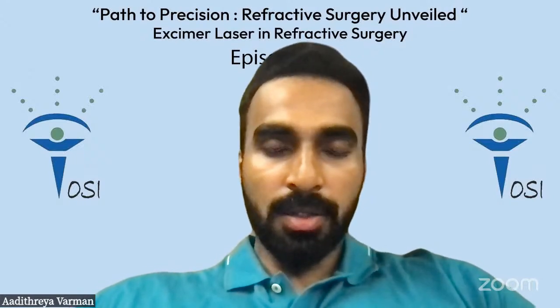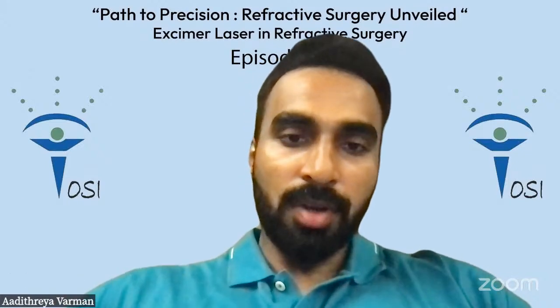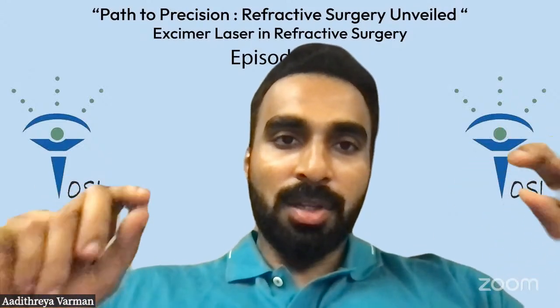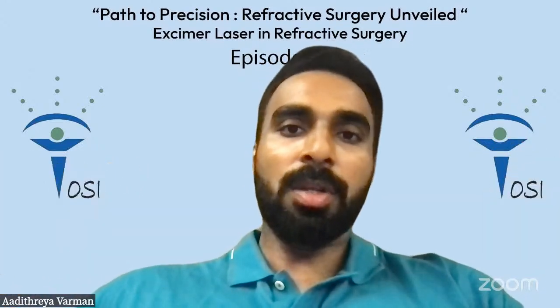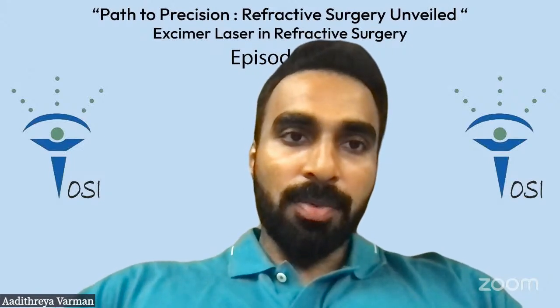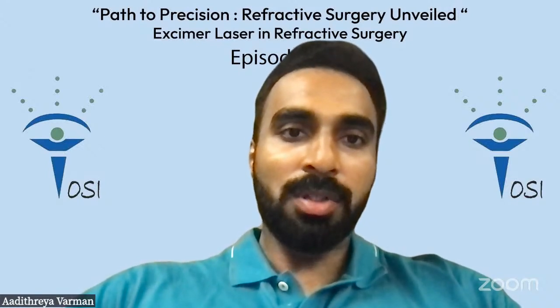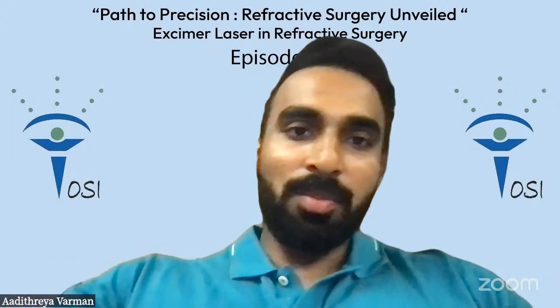A lot of beginner surgeons, we see, are very anxious about having interface debris, and after putting the flap back, you start overhydrating, you move in a circular fashion, and you inflate the flap. It becomes like a steak. It becomes so thick that it's impossible to know whether you've replaced it correctly. If you overhydrate the flap, you push it back and think it is even, but the next day after the flap dehydrates, you see on slit lamp flap crunch. You'll see microfolds only towards the nasal or the temporal side.